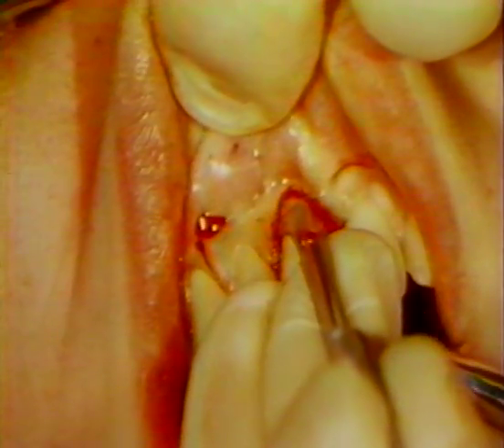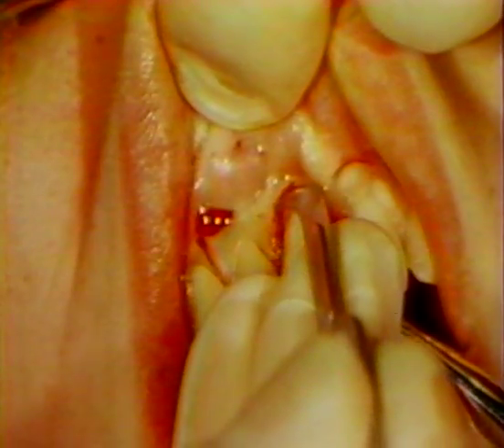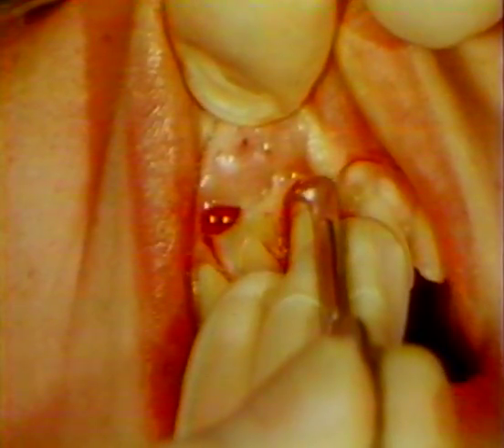Another incision is made along the distal aspect of the central incisor and also extended into the alveolar mucosa.